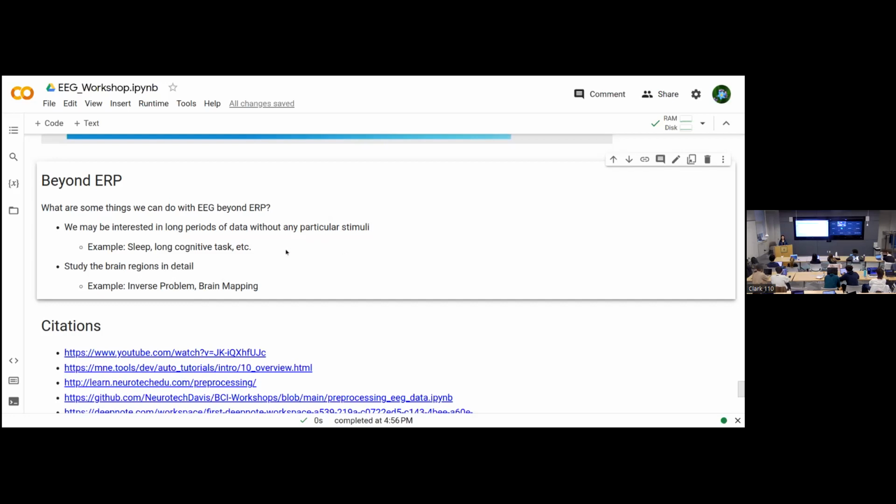And then also, there are some cases, so for example, in a project I've done before, we were using EEG to detect differences between subjects, where one group of subjects learned their second language very early, and the other subject group learned their second language very late. And we had them complete a writing task, during the entire duration of which we recorded their EEG while they were completing a writing task in their second language. So you can see how that entire period of data doesn't necessarily correspond to a specific event. And instead we're looking for general trends and differences within those 2 subgroups.